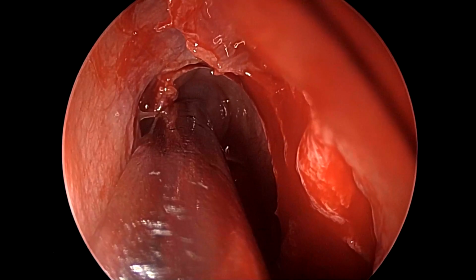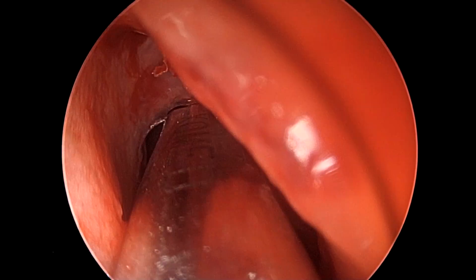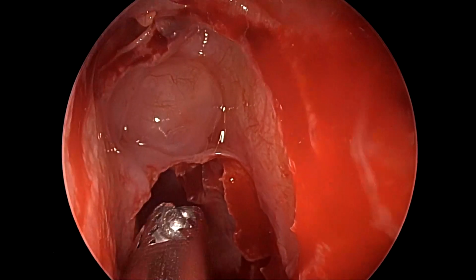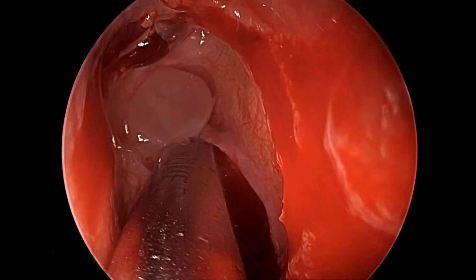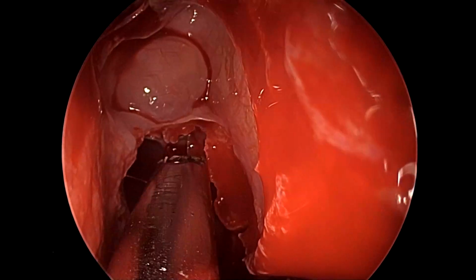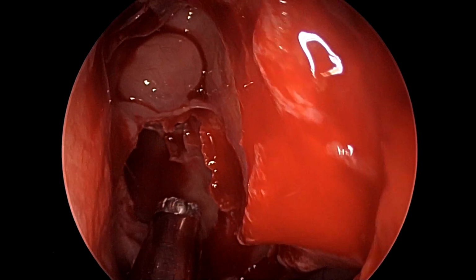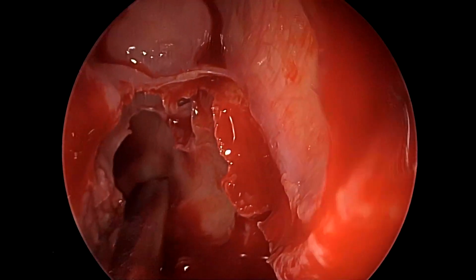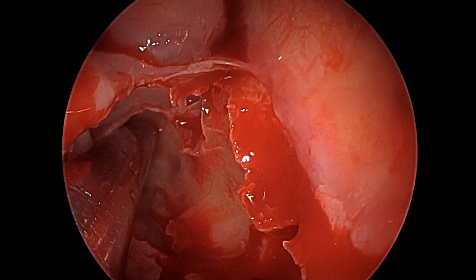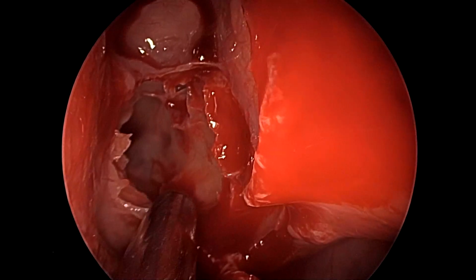Some excess mucosa and bone around the frontal recess area is also trimmed carefully to be able to again achieve an unhindered access with a 0-degree scope towards the entire meningocele and the fovea defect. The meningocele is not a concern. The concern is the fovea defect. The fovea defects are small and the meningocele is big, but as soon as we coagulate or ablate it, we would have to precisely locate the defect for precise closure.